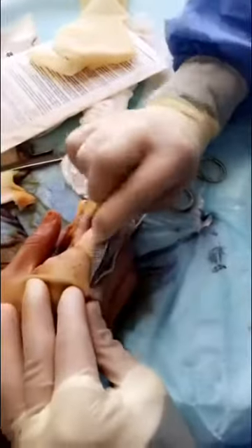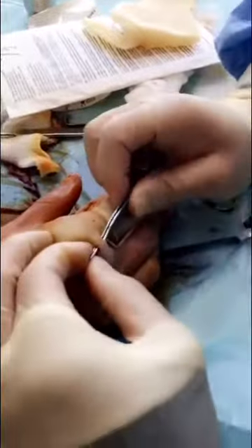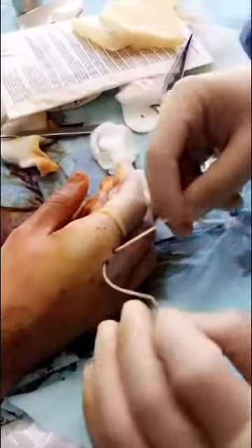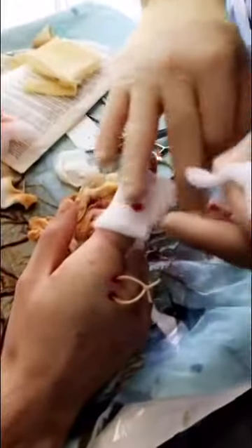I'm putting in a drain here so that everything in the injury can drain out. There you go. Everything went great — no injuries. I'm really happy, and now I'm just going to bandage it all up.